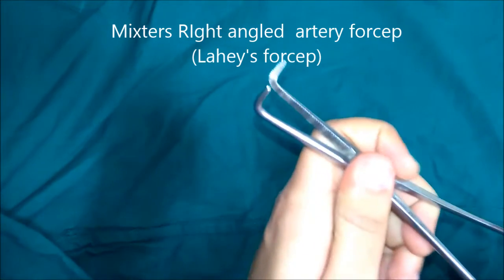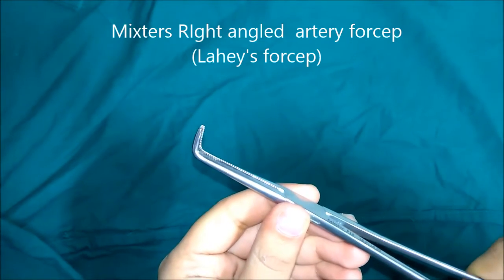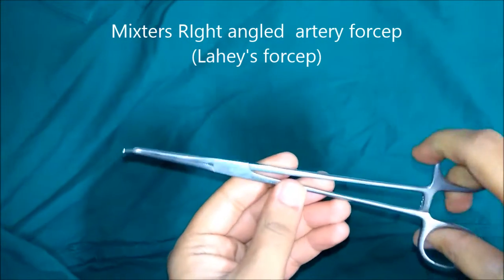This is Mixter's right angle artery forceps, also known as Lahey's forceps. The terminal part of the blades are bent at right angles to the shaft of the instrument, and there are transverse serrations in the blade. Due to this right angle bend, this instrument is usually used to pass a ligature around a dissected vessel.